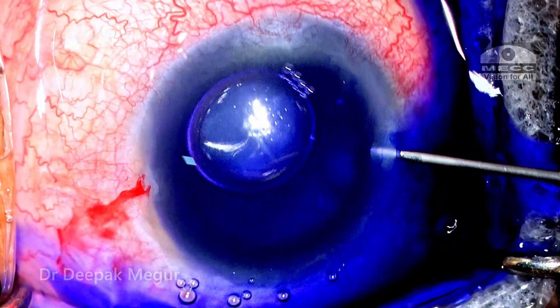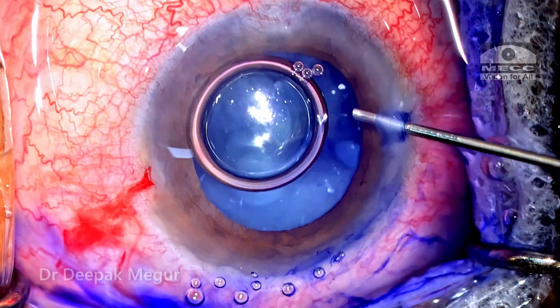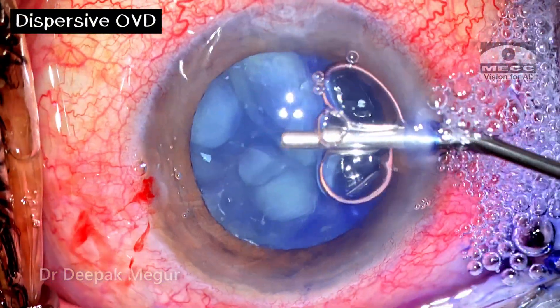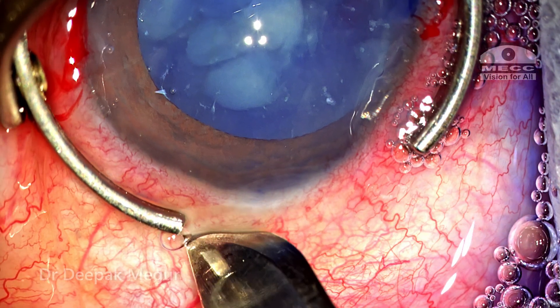As the dye is being irrigated out, I'm also hoping that all the lens particles which would have diffused out of the capsule bag into the anterior chamber would also be irrigated out, so that visualization would be much better. Dispersive OVD is used in the anterior chamber to deepen it, and a 2.8 mm sclerocorneal incision is being made.